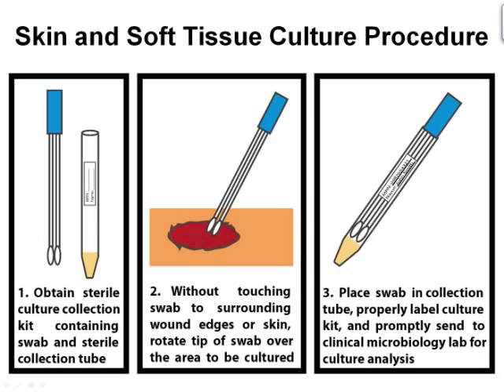Secondly, the swab is rotated over the middle area of the wound carefully so as to avoid contact with the surrounding edges. This will minimize possible contamination caused by normal skin flora. Lastly, the swab is placed in the collection tube, labeled, and promptly sent to the clinical microbiology laboratory, where the specimen will be spread over agar and incubated.